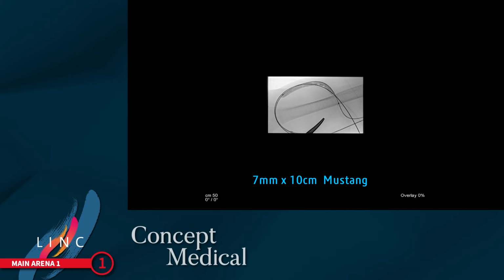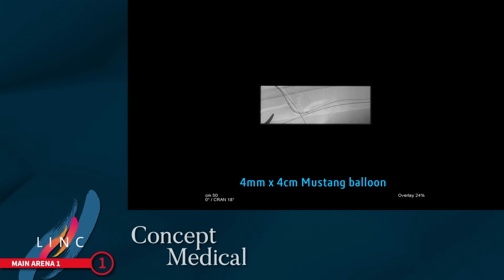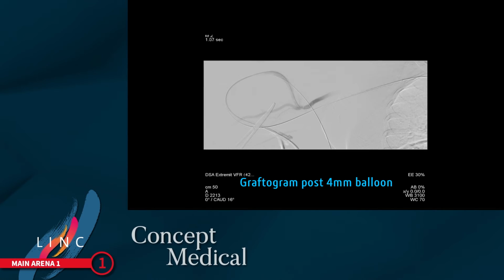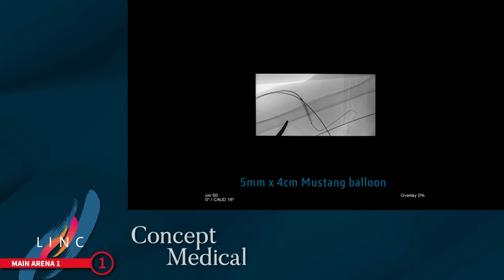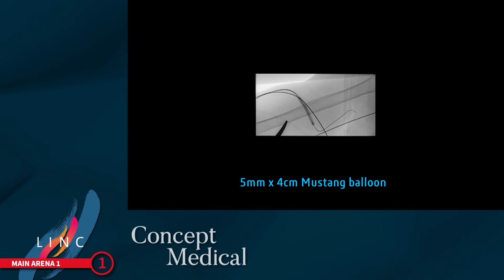This residual thrombus is macerated using the same 7 mm by 10 cm Mustang balloon. The arterial graft junction is treated with the 4 mm by 4 cm Mustang balloon. This will serve to plasty and increase the size of the vessel, and this is how it looks after a 4 mm balloon. Still some residual thrombus within the arterial limb of the graft, and this is macerated with a 5 mm by 4 cm Mustang balloon.